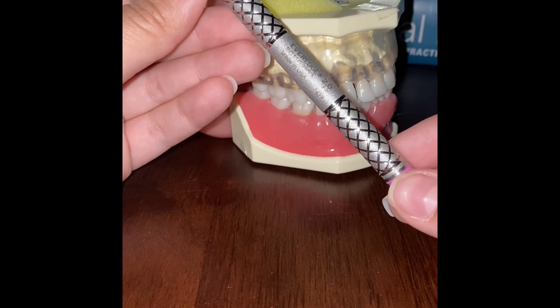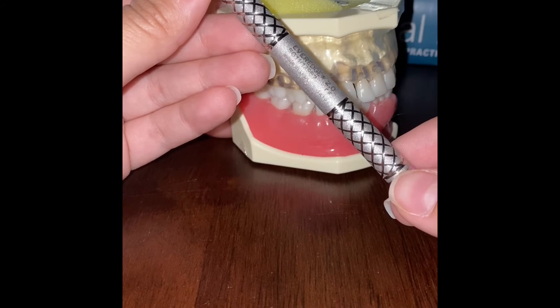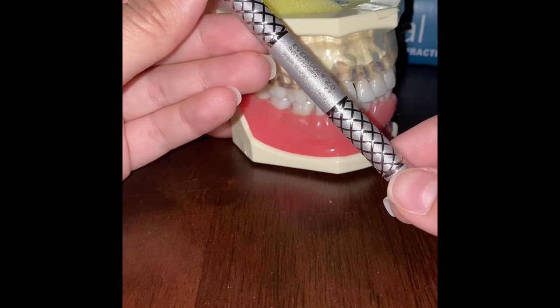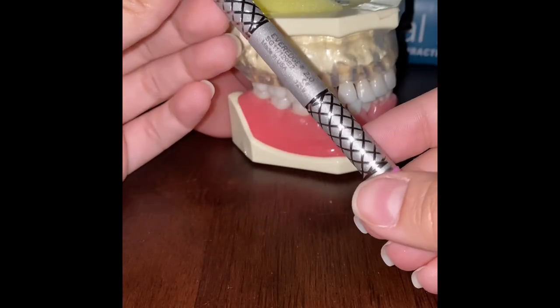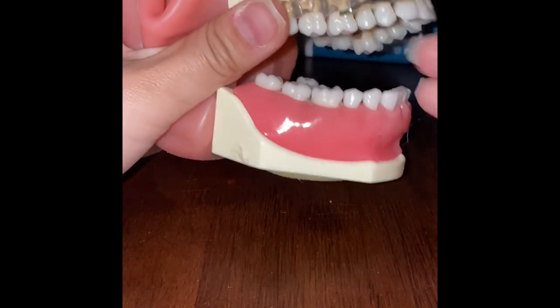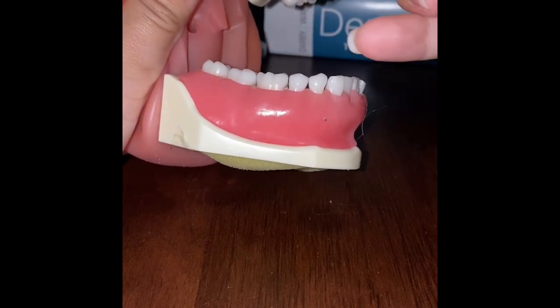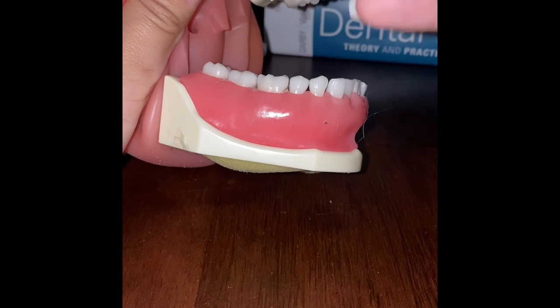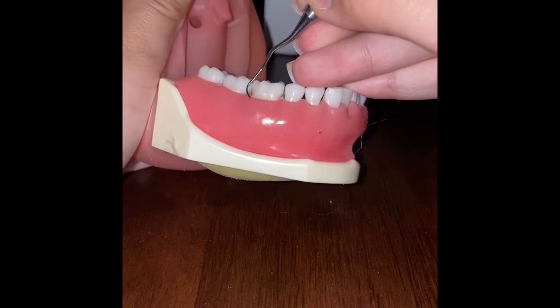Finally, the Gracie 11-12 curette is another area-specific curette used on the posterior buccal and mesial surfaces. Similarly to the other Gracies, the 11-12 has one cutting edge — the lower blade — and a rounded toe. The face of the blade is at a 70-degree angle to the terminal shank. I'll demonstrate this on teeth 29 and 30. Since we're working mesially, we find the lower blade and begin at the distal line angle.